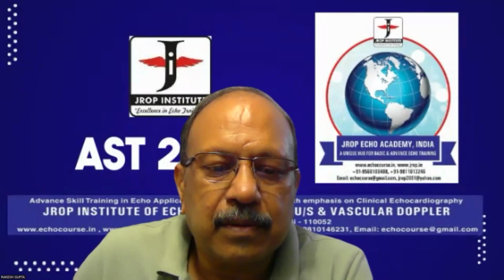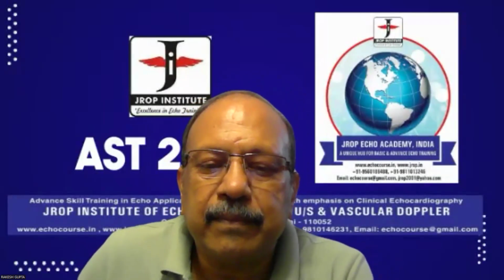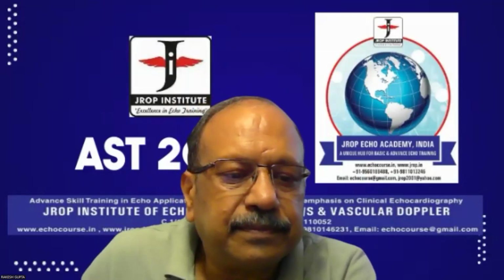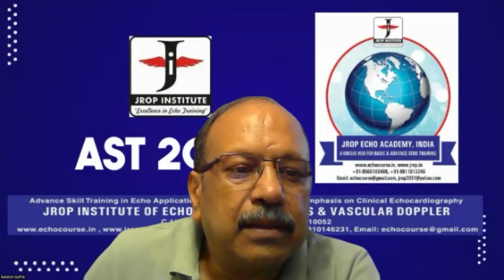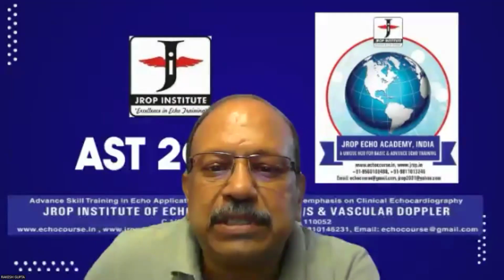She was telling now about the sawtooth, sir. What is that sawtooth? We saw something in ECG for that. Sawtooth is a manifestation of aortic regurgitation. Which tracing, sir? In M mode, the aortic box. M mode. I'll just show you M mode. Give me a second.